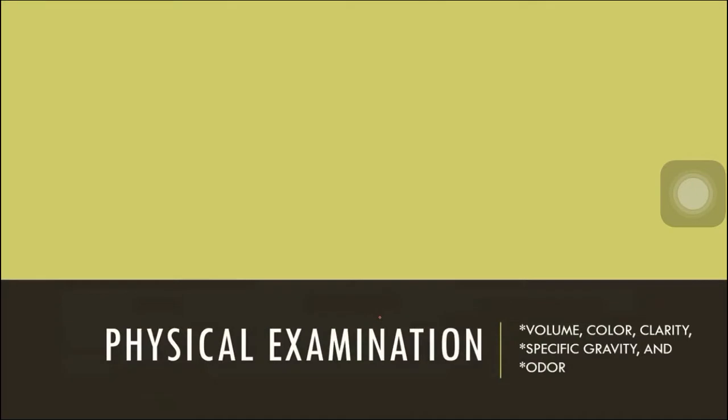Okay, so let's talk about physical examination. In the physical examination, we're going to talk about volume, color, clarity, specific gravity, and odor. Those with asterisk are the tests not usually included in the routine physical exam. Because volume and odor, di na siya usually ginagamit for the routine physical exam.